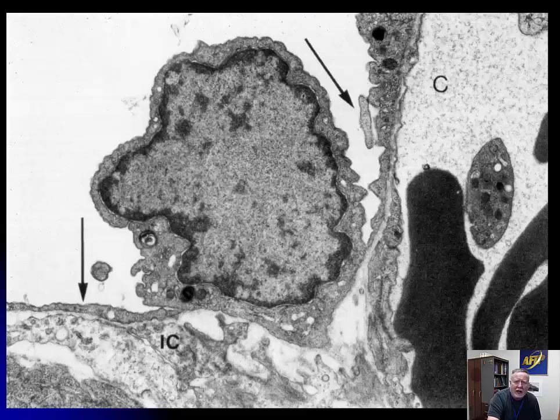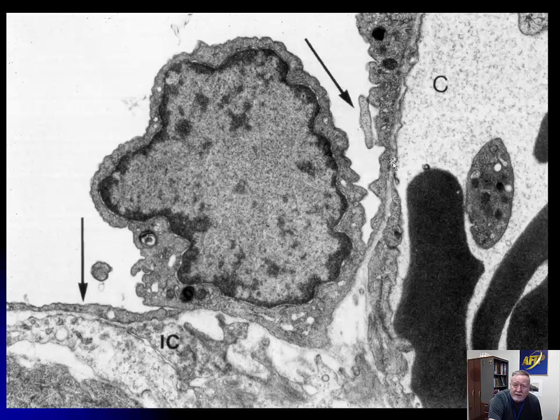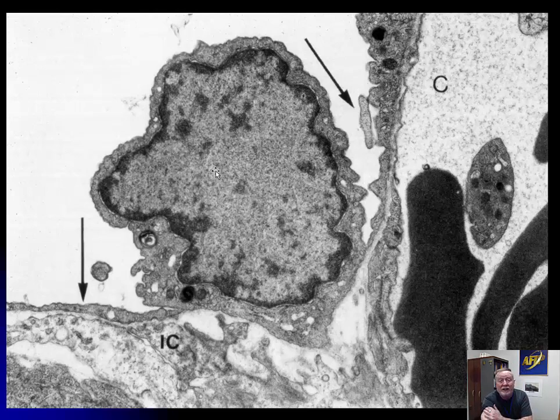At higher magnification of the type 1 pneumocyte, we can see the erythrocytes confirming we are in a capillary, and also a platelet — a little anucleate cellular material surrounded by a membrane with a number of granules. Here is the basement membrane of the capillary, and here are the processes of the type 1 pneumocyte, which are extremely thin. The nucleus is visible, but there are not a lot of organelles. These are serendipitous pictures but very important for seeing the thin processes of the type 1 pneumocyte in the normal lung.